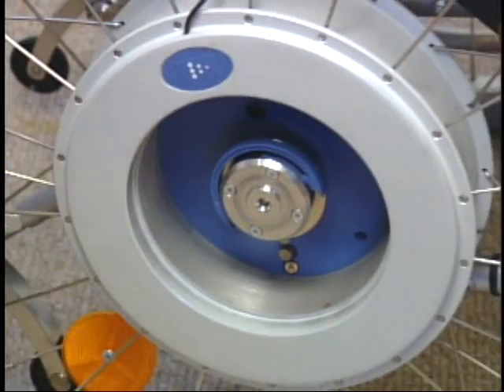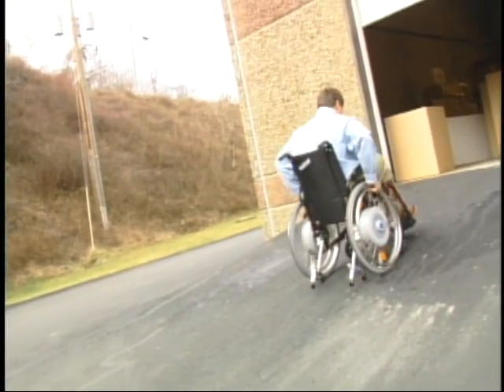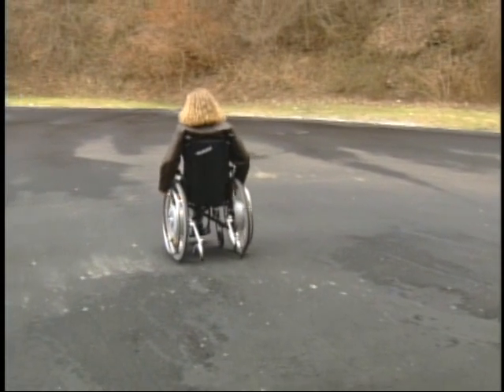The brushless maintenance-free motors and rechargeable batteries are contained in the Emotion's wheel hub. Emotion provides substantial torque to overcome hills with an incline of up to 20% with ease. It also assists the user by reducing speed when traveling down hills.